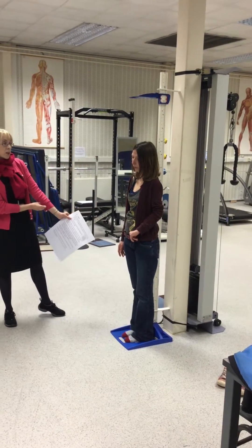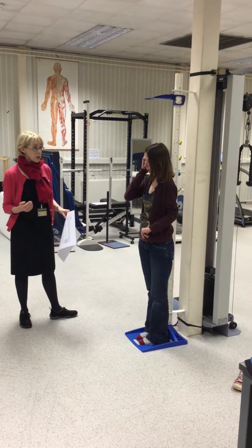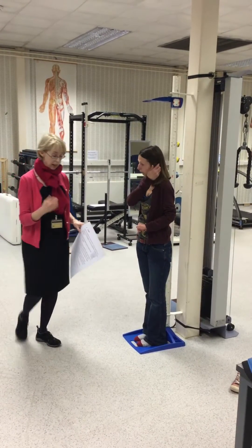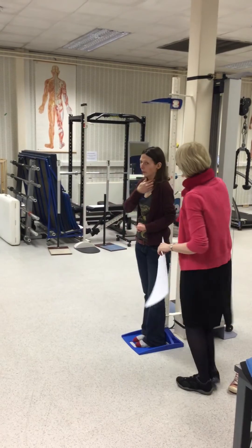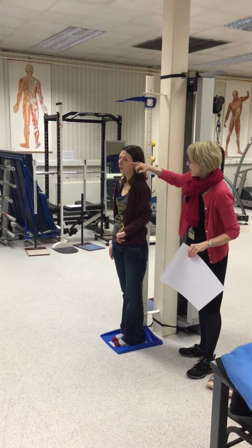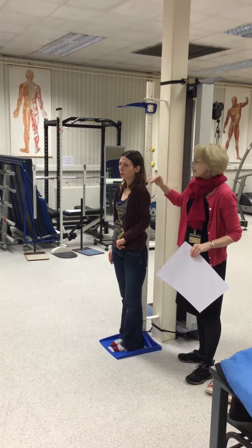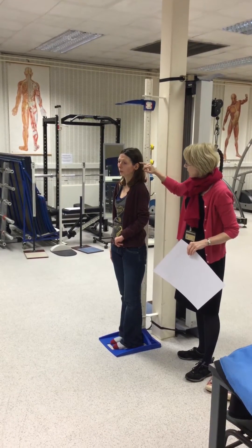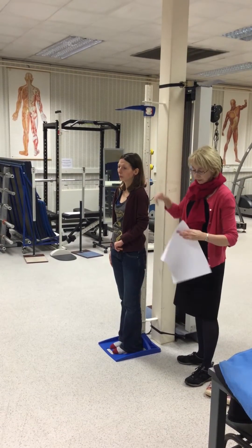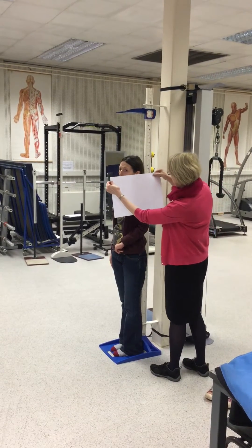The next thing we need to do is to adjust the head so that it's in the Frankfurt plane. To be able to do that, I need to ask Lee to show her ear. What we're looking for is to make sure that her eye socket and the top of her ear canal are in a line — the ear canal, not the external part of the ear that you can see, but the little hole in the middle.